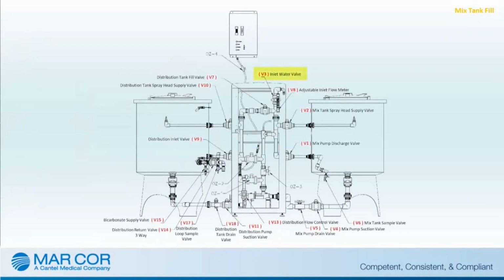Warning: the inlet water valve V3 should be closed at all times except when the mix tank is being filled with water. The transfer valve V7 should remain closed at all times except when intentional transfer of solutions is to occur. If these valves are left open during treatments and the inlet solenoid valve fails, the bicarbonate solution will be diluted, causing interruption of treatment.